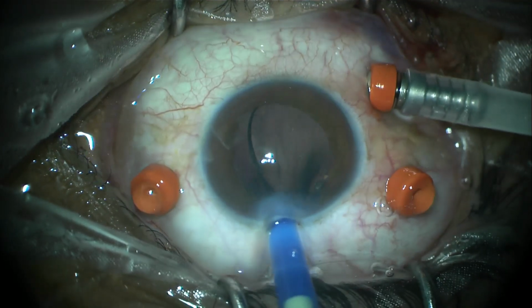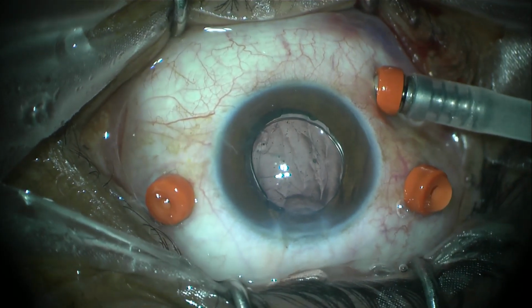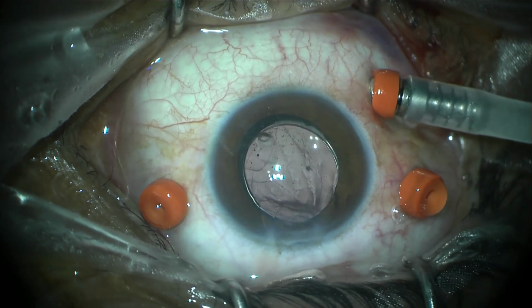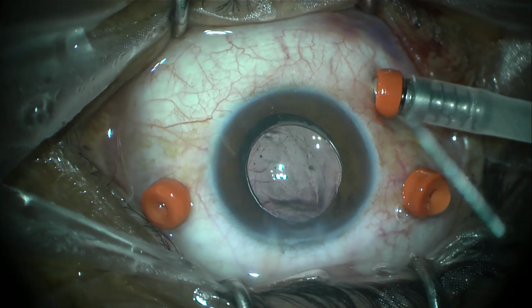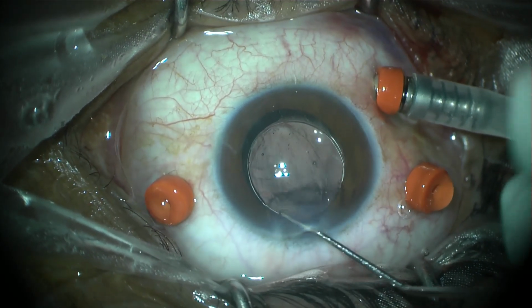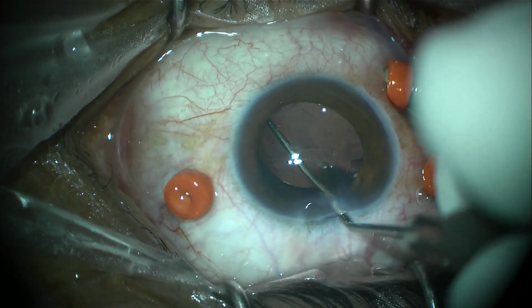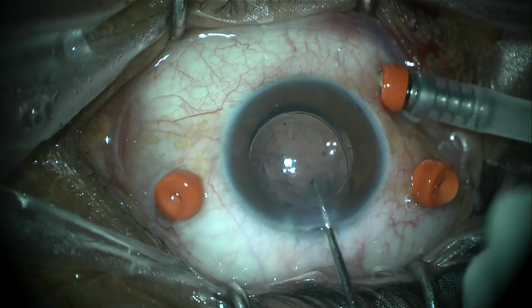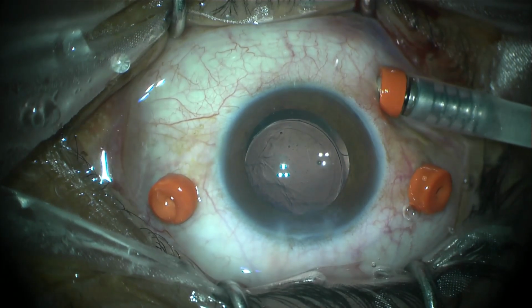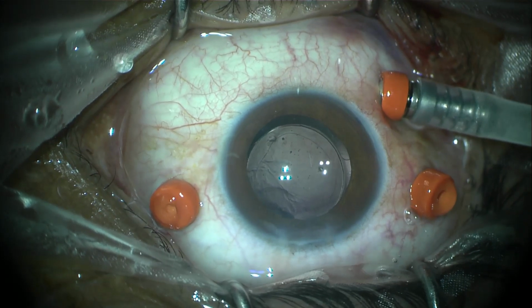This is a single piece hydrophilic monofocal IOL. The leading haptic goes directly into the bag, and the trailing haptic can be dialed into the bag. This is the trailing haptic, and we can see it is being dialed into the bag after negotiating the anterior capsular rim. The IOL is securely held in place, and now it is time to create a PVD.